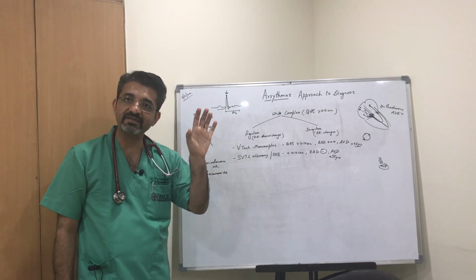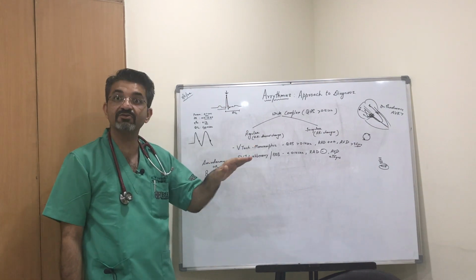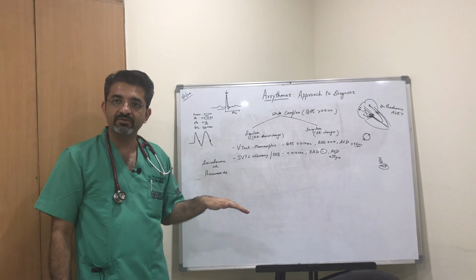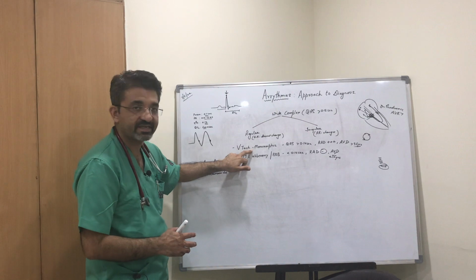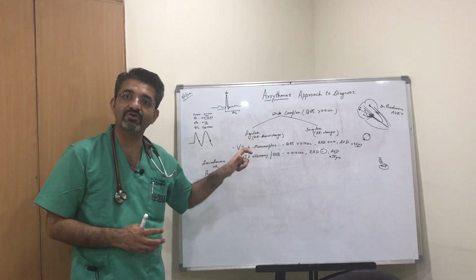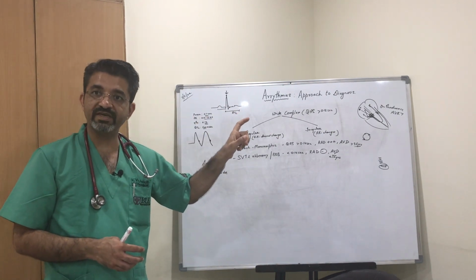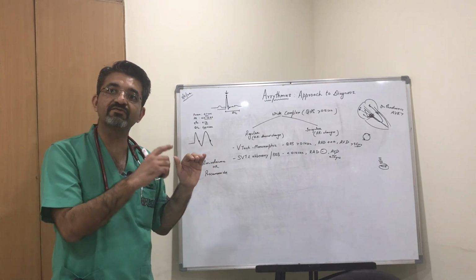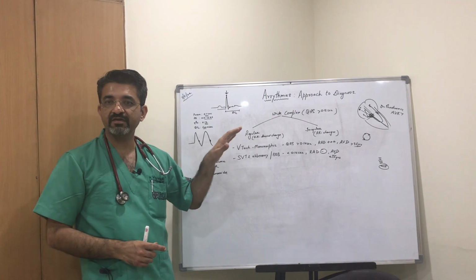Most of the time that's ischemia. So you can find some T wave abnormality, you can find ST segment depression or ST segment elevation. You can have troponins which are high. So always try to search, particularly in monomorphic VTach, whether there was some underlying ischemic insult or not. You may not find it in the VTach ECG, but when the ECG reverts to normal, you can find some ischemic insult going on.